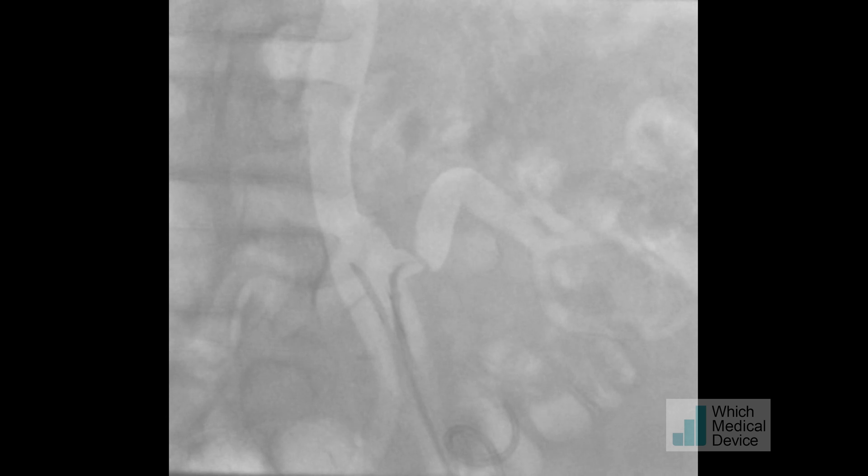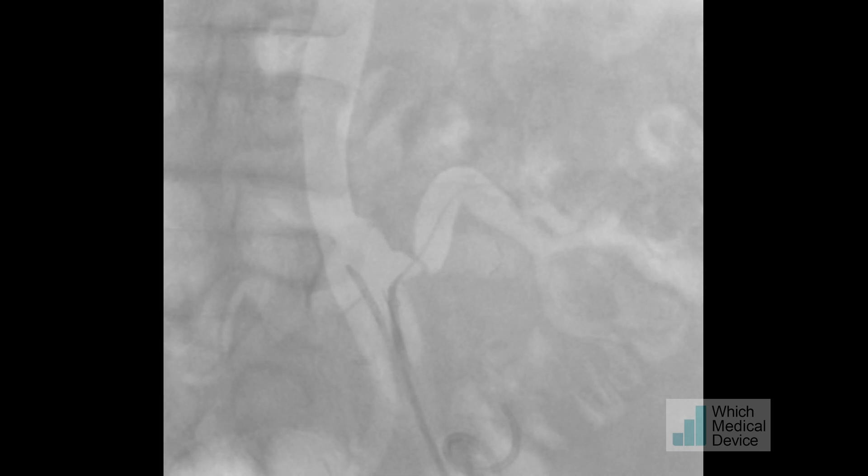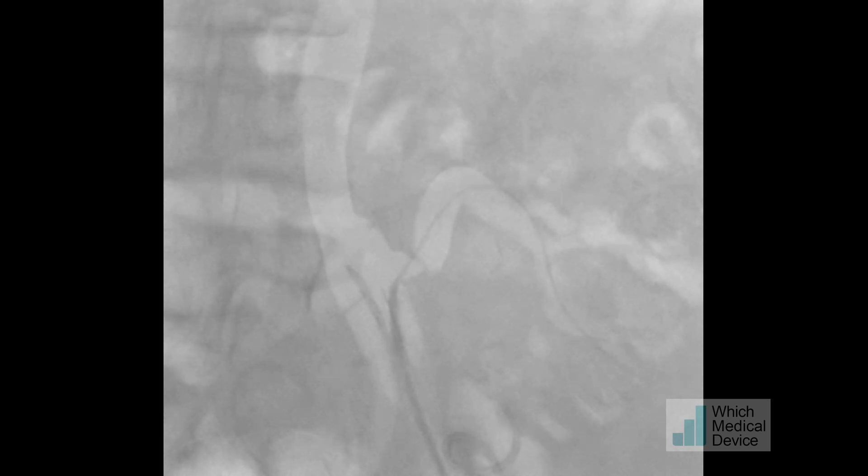It's important to try more anteriorly and more posteriorly as well, because the artery isn't always coming off directly laterally where you think it is. I also have the tube obliqued along the line of the artery. I was just about to give up and try an 018 wire as my next device when we managed to get through this stenosis and down into the main renal artery. I'm now placing my wire more distally in one of the more inferior branches to give support.